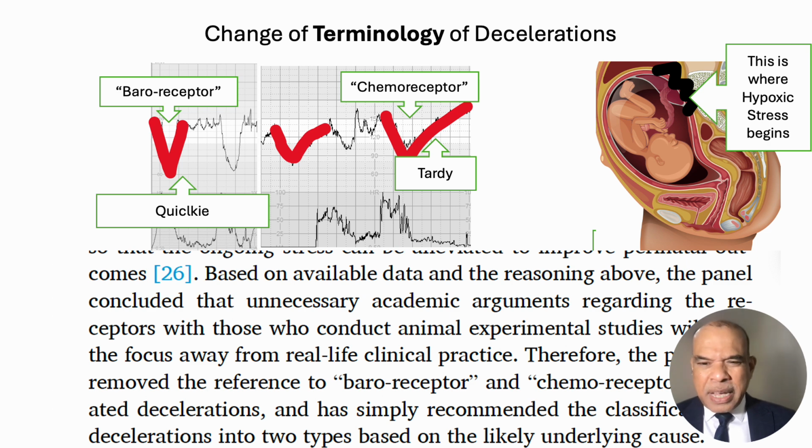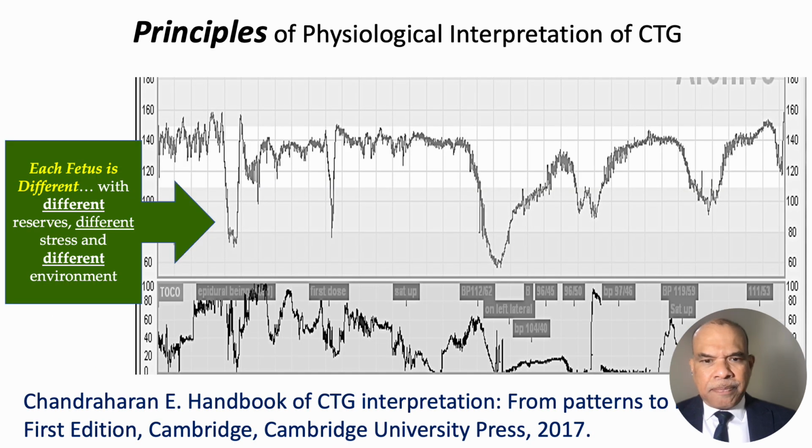And therefore, we need to make a clinical decision based on the parity, progress of labor, presence of meconium, etc. So you can see that is the controversy for some because of the change of terminology, but we had to do it to protect women and babies by stopping these illogical arguments in trying to translate and transpose the data from animal studies.